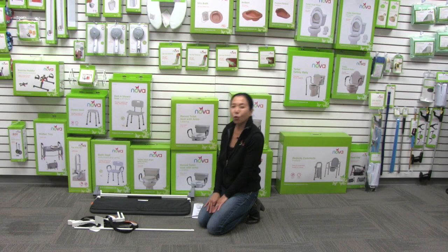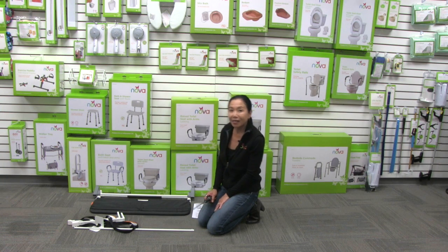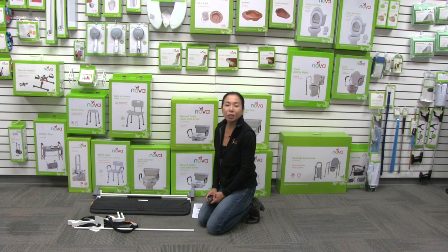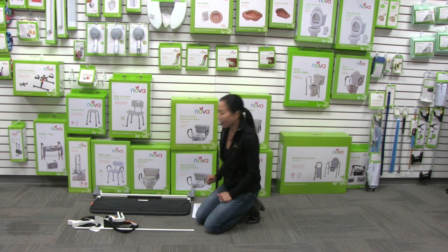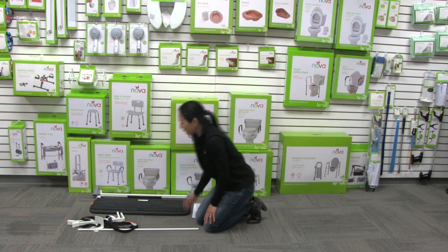I'm going to show you the very quick and easy assembly of your folding bed rail. It's only going to take a few minutes and the only tool you're going to need is a Phillips screwdriver. When you get the contents out of the box you're going to have the bed rail, the pole, and the bracket.